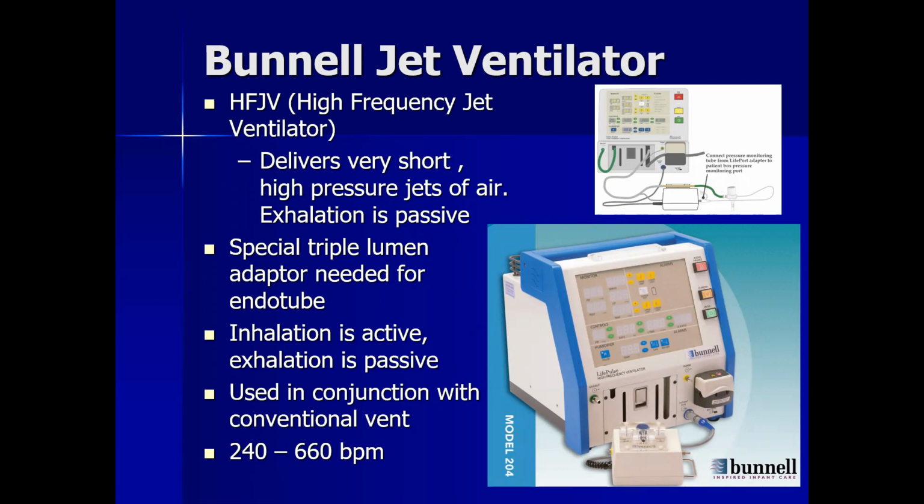The Bunnell jet ventilator. HFJV stands for high frequency jet ventilation. So when we say high frequency ventilation, we're just using a general term. And then to be more specific, are we talking about the jet vent? Are we talking about the oscillator? That's when you would say high frequency jet vent, or for the oscillator, high frequency oscillator.